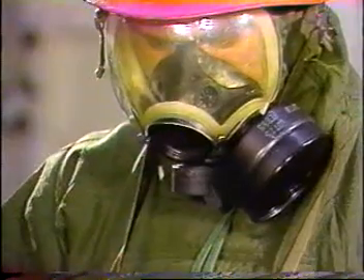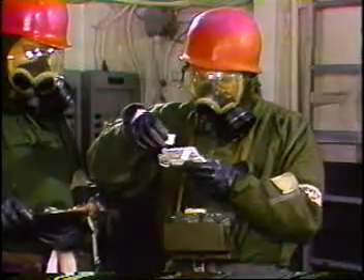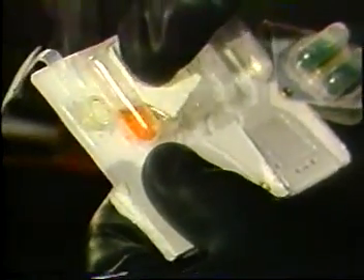Rotate the sampler detector so that the test spots are down. Check to be sure that the protective strip is over the test spots. Using the cardboard square and the thumb of the right hand, force the liquid from the crushed ampules down to the test spots. At the same time, use the left thumb to press on and massage the protective strip over the nerve agent test spot to ensure wetting.